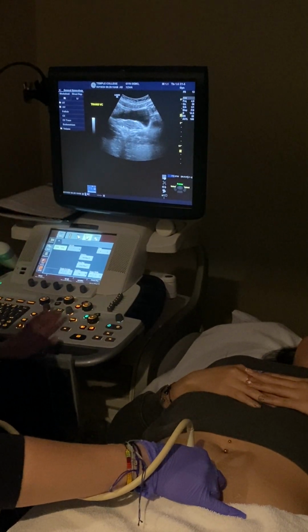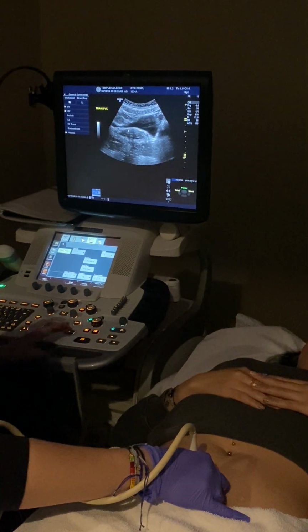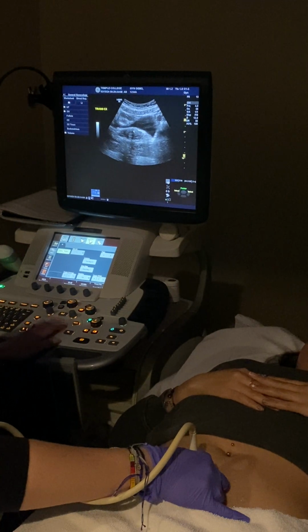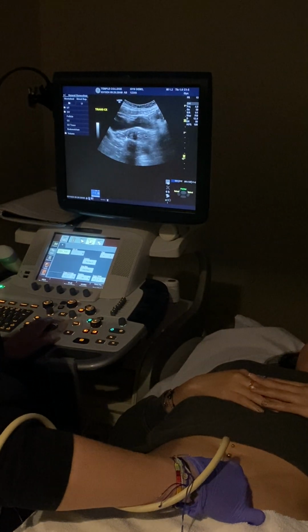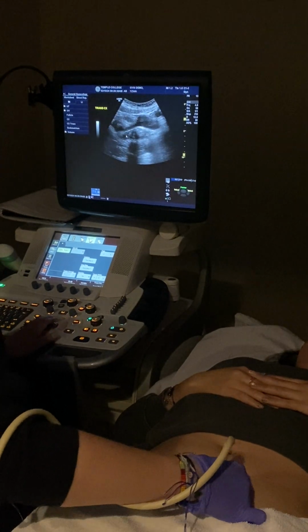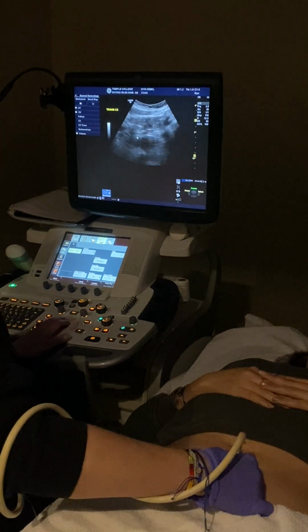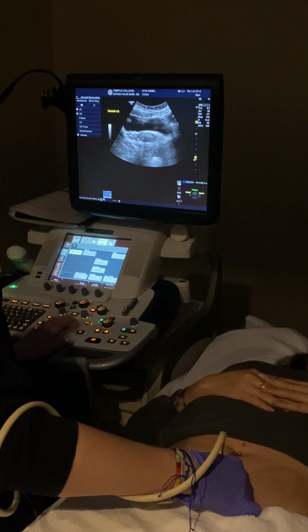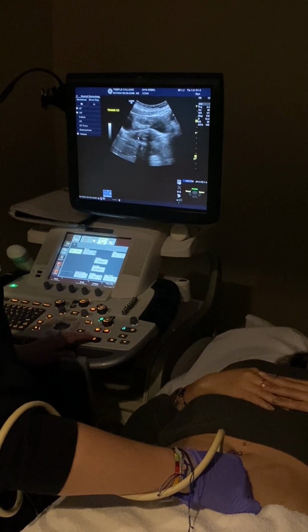Aiming superior towards her head, and you're going to see cervix. So this is transverse cervix. Right here. Okay? Now I want to get it midline and behind the bladder. So now do you see how I've had to kind of move around? This rocking back and forth, that's going to bring you into the center of your screen. So once I've aimed up here, now I'm going to be in the cervix.